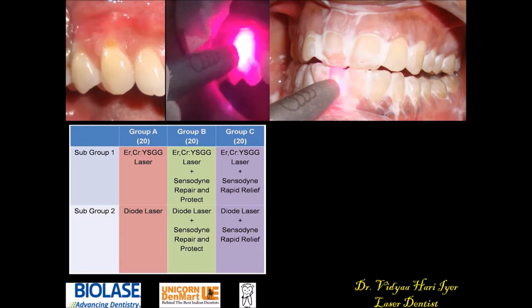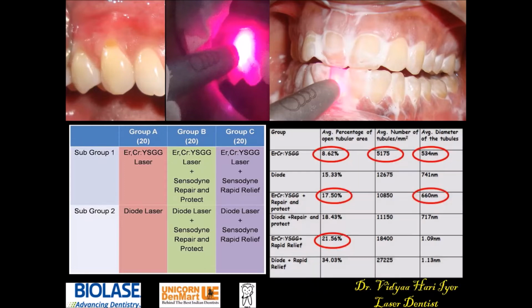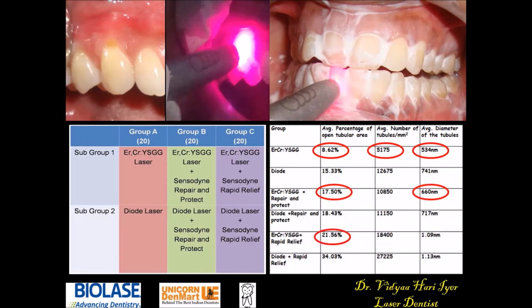So friends, if you have only the option of a desensitizing paste, I understand. However, if you go to a dentist who can work with a diode or erbium laser, then you would see a marked reduction of the sensitivity, showing that lasers have truly given you the kind of advantage you are seeking.